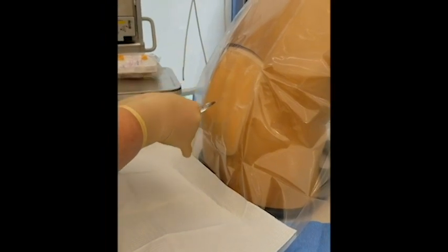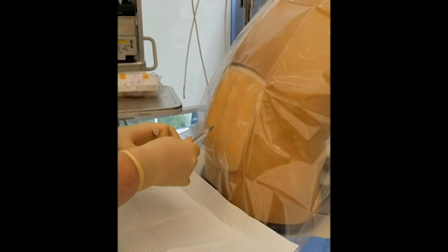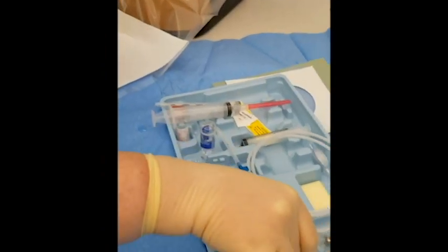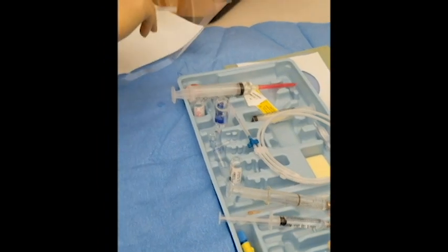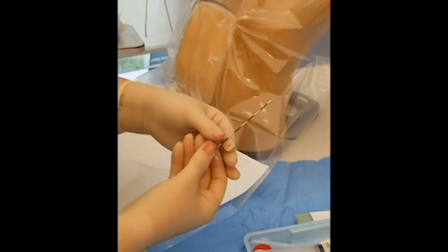Use a small needle as a seeker to find where the bone is, as well as ligament.